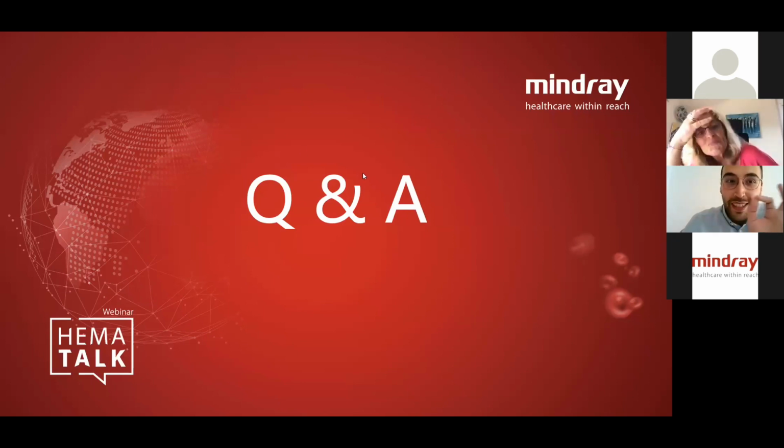There is one more question, the last one. Yes. Do automated smear analysis systems accurately count abnormal cells and young forms? Quite good. They are quite good, yeah. When they alert for an immature granulocyte population, usually you find left shift and immature granulocytes. I think, yeah, it's quite good with respect to this question. Thank you very much for all these questions and for sharing this presentation with me. I hope you like it.